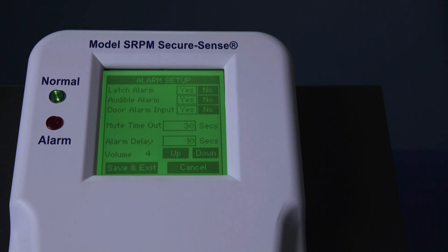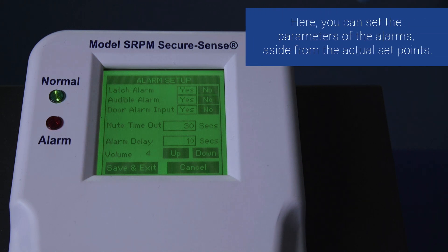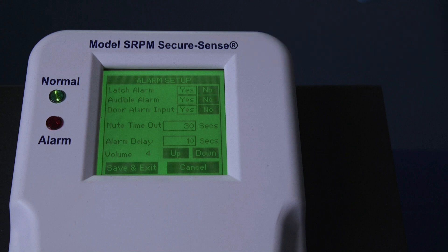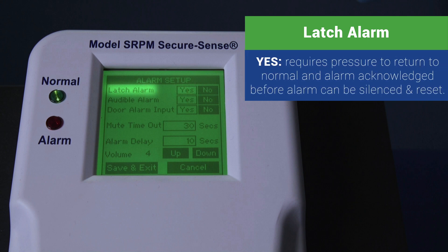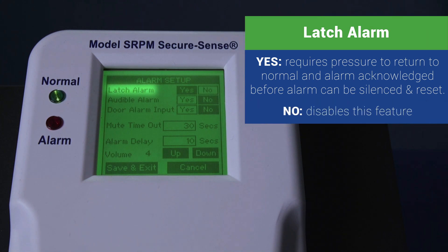Once at the alarm set up screen, you can set the parameters of the alarms outside of the actual set points. Latched alarm: Yes requires the pressure to return to normal and the alarm to be acknowledged before the alarm can be silenced and reset. No disables this feature.